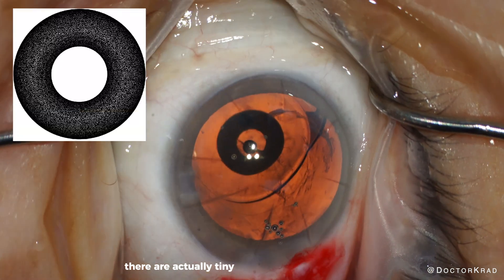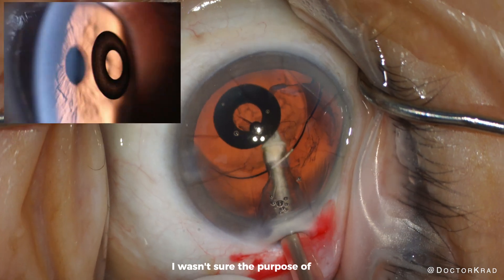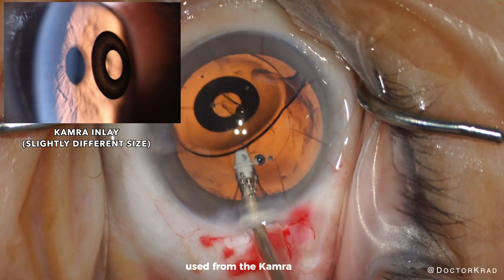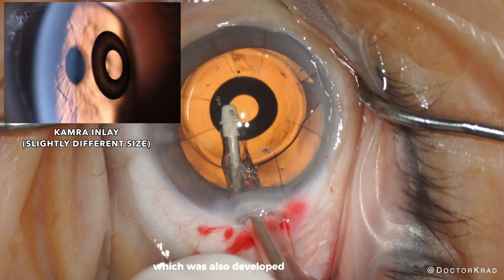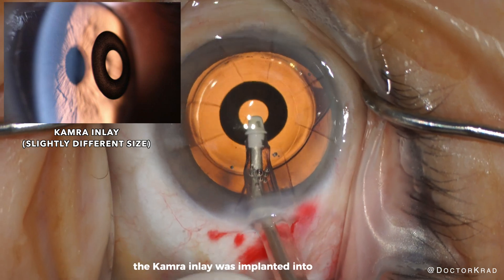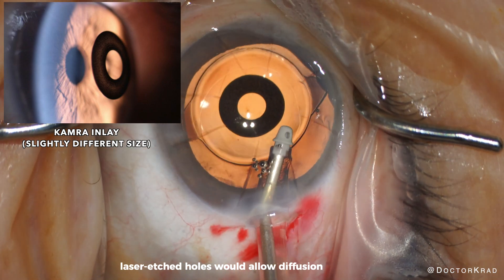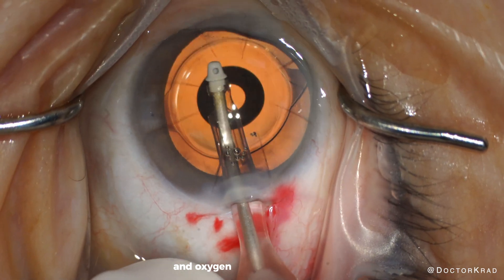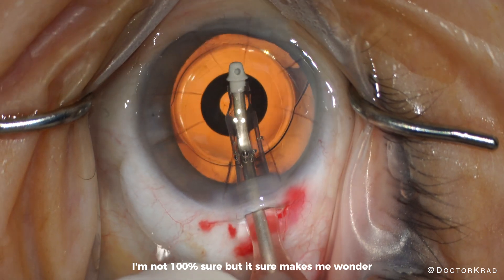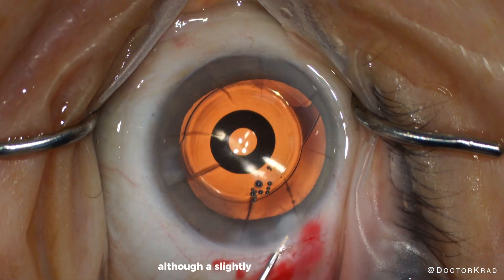There are actually tiny perforations within the inlay. I suspect it's the same opaque ring used from the KAMRA inlay, which was also developed by AcuFocus. The KAMRA inlay was implanted into the cornea and those little laser-etched holes would allow diffusion of nutrients and oxygen through the cornea. I'm not 100% sure, but it makes me wonder if this opaque ring is the same one used in the cornea, although a slightly different diameter.